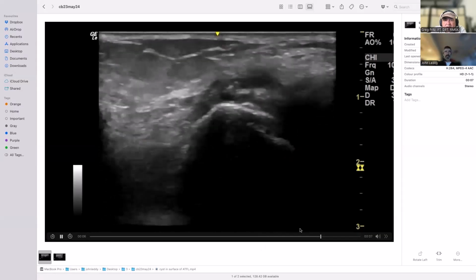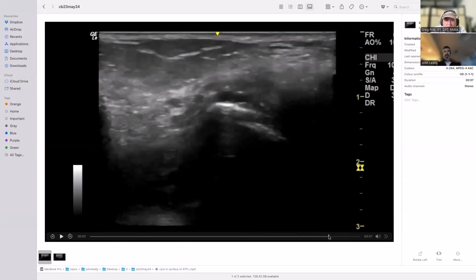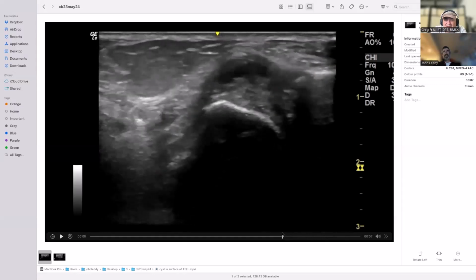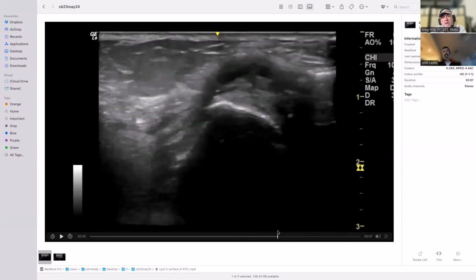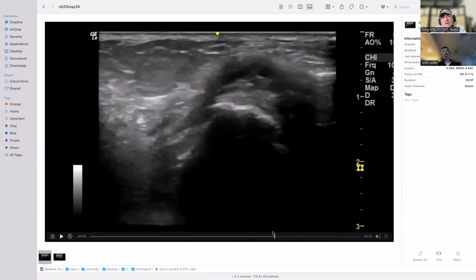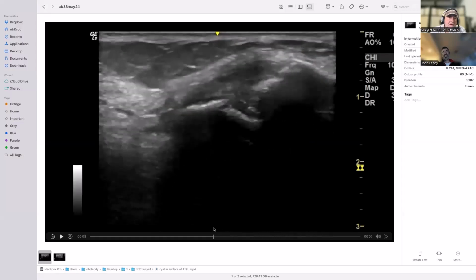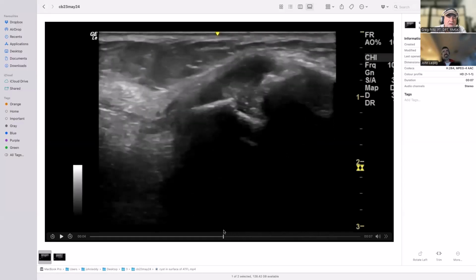But if you pull it back, let me pull it back. Look through there. There might be a little tear coming through up somewhere there. Bit of breakdown in it. I think it's torn. It's a bit of fluid broken into it, or just literally a blister. A ganglion or a cyst forming up in the ligament there. But whatever it is, just interesting.